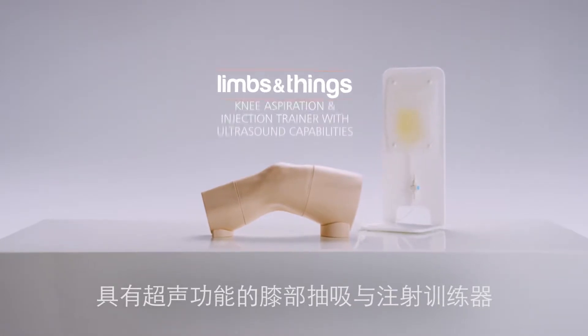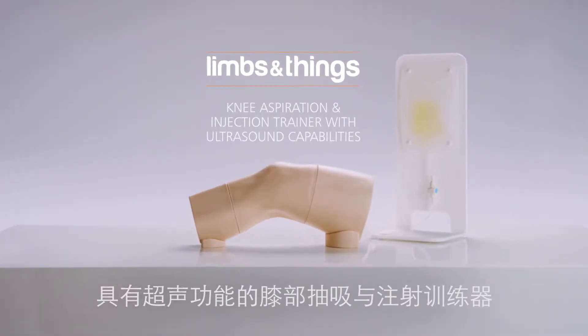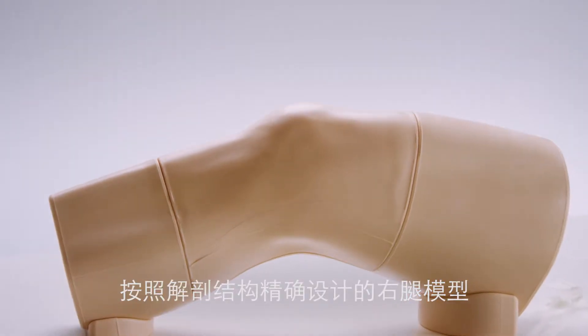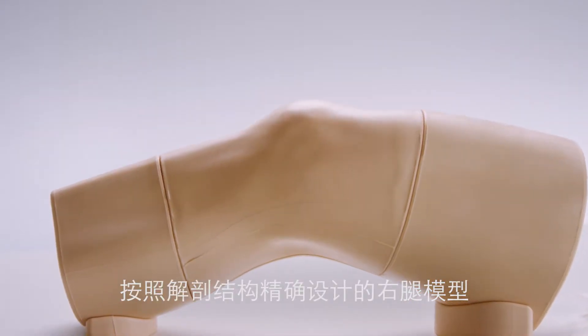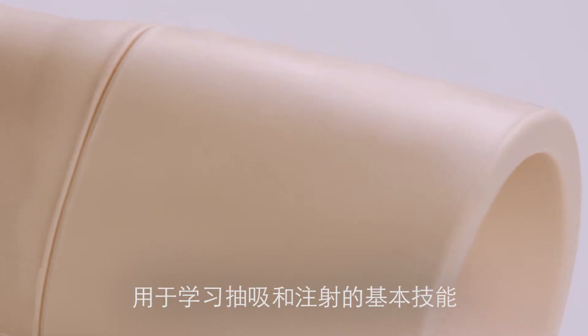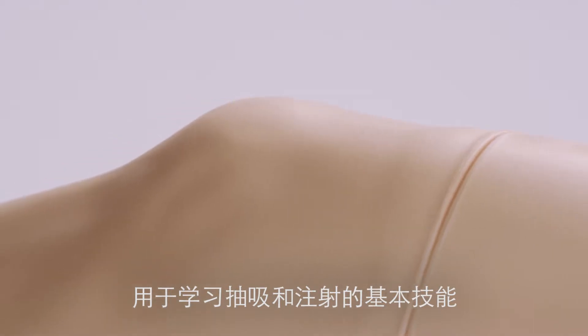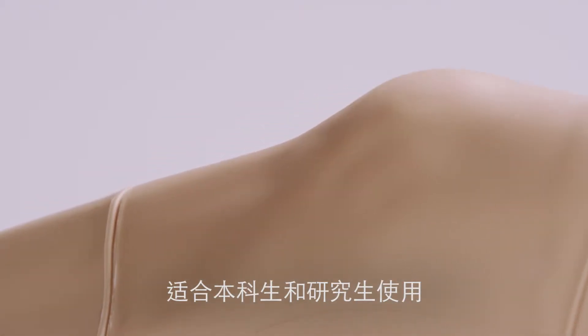This is the Limbs and Things Knee Aspiration and Injection Trainer with ultrasound capabilities. Designed in conjunction with clinicians, it is an anatomically realistic adult right knee for teaching the fundamental skills of knee aspiration and knee joint injection to both post-graduates and undergraduates.